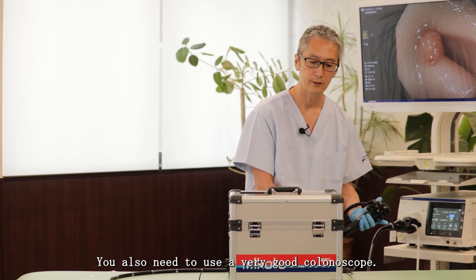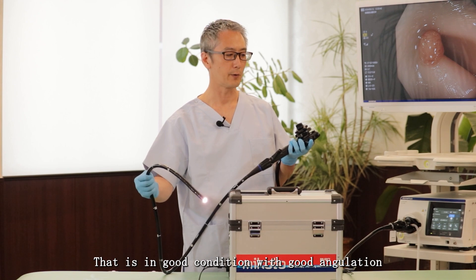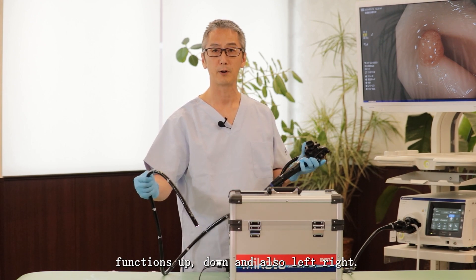You also need to use a very good colonoscope in good condition with good angulation functions — up, down, and also left, right.